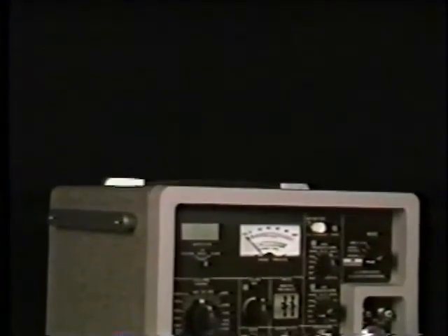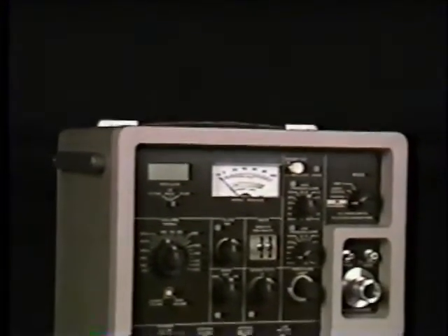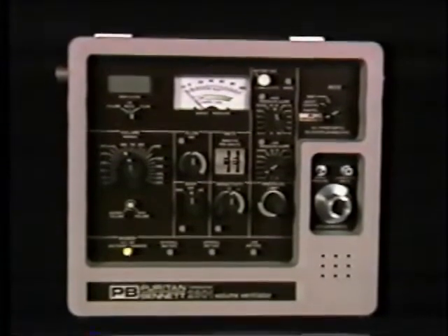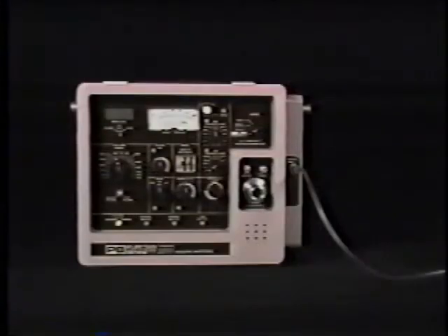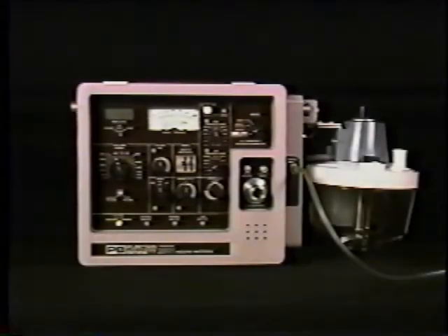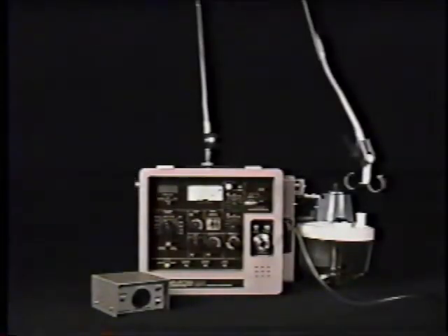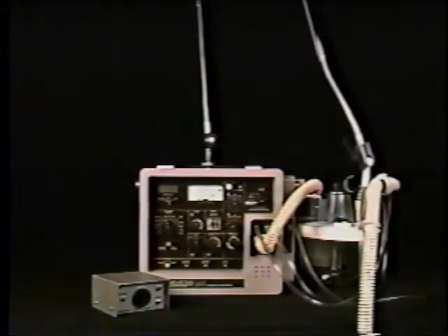The Companion 2801 is a microprocessor-controlled portable volume ventilator, which provides positive pressure breathing support for the ventilator-dependent patient, both adult and children. The ventilator is designed to be used with the oxygen accumulator, optional Cascade 1A humidifier, the Companion remote alarm, and the Puritan-Bennett support arms. Puritan-Bennett recommends that its reusable patient breathing circuit be used.